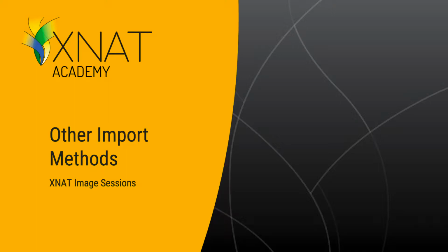There are other ways of getting image session data into your XNAT, and there are some advantages of using those methods. I'm going to talk about three of those right now. One is using a desktop installed application called the desktop client. A second is inserting a step in between a PACS system and your XNAT called a CTP. And a third is taking advantage of XNAT's API using an external script.